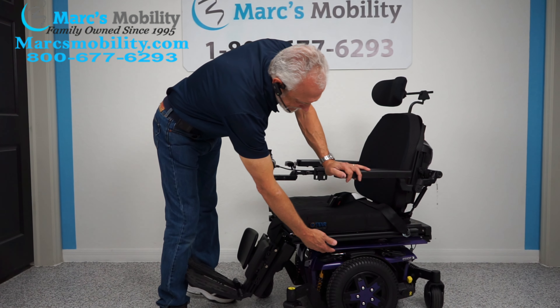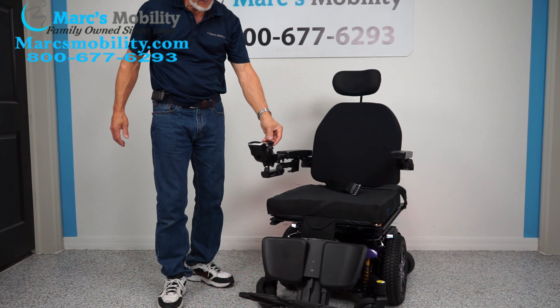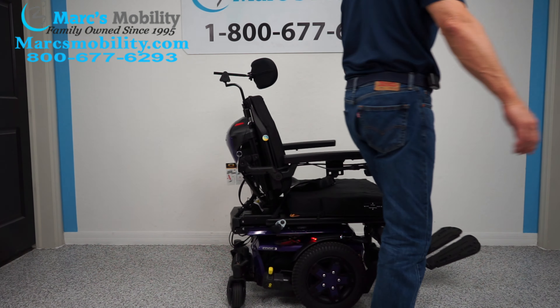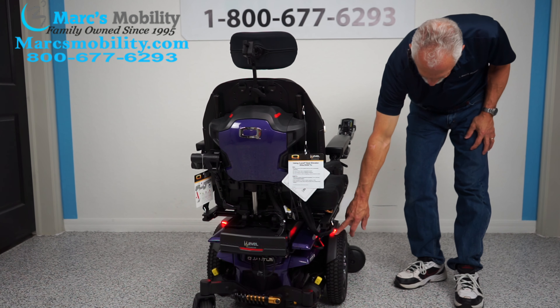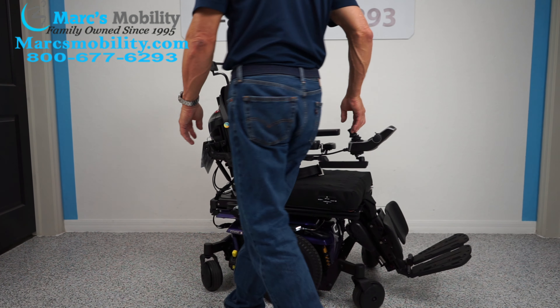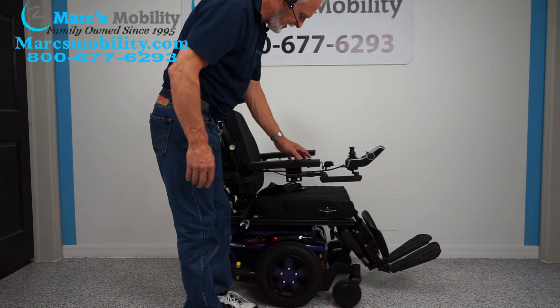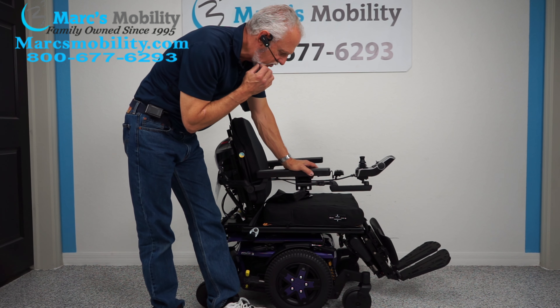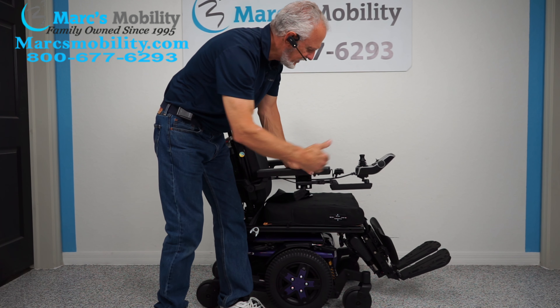Just let us know when you're looking at a chair. This chair also has lights. There's a button here — if I tap it, you can see there are headlights right here and tail lights back there. So if you're in your house, you'll be able to light up your hallway. I'm not sure you'll be able to go on a highway with it, but let's turn the lights off.